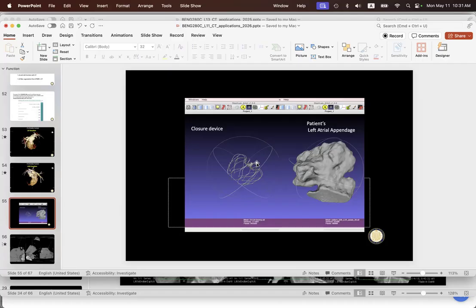And then this is a little screw receiver, and you unscrew the catheter that you brought it in on, and you pop it off, and you just leave it here. And then ideally, it just endothelializes, and you get a nice smooth surface, and you have completely isolated the blood in that left atrial appendage that was not flowing.